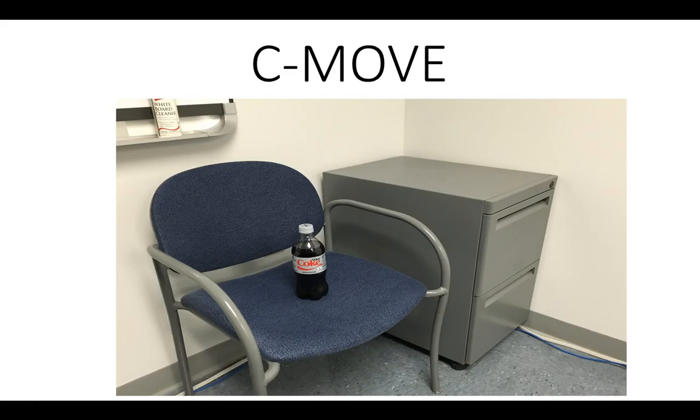C-move is used to move a whole study, both the image pixel data and the DICOM header all together, from one place to another. In DICOM terms, from one application entity to another. C-move uses 2 connections to move data.